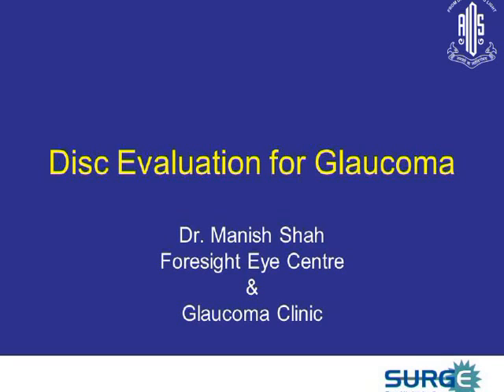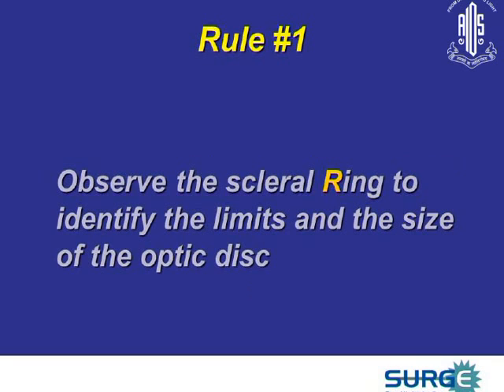And I would also like to point out that Pradeep has shown us what OCT can do and what OCT cannot do. And the most important thing is that if you do any imaging test or you do perimetry also, I would insist that you should first see the optic disc clinically before you start interpreting all these other tests. If you don't follow a systematic protocol of clinical evaluation first, followed by the imaging tests, you are likely to be misled in a lot of situations.